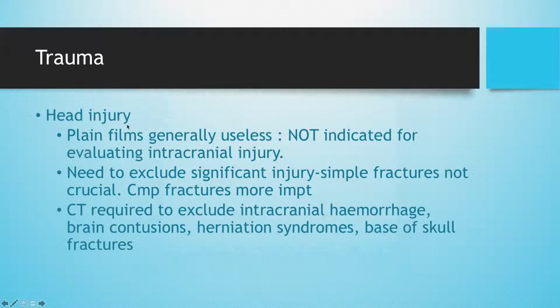We have a patient with head injury. Plain films are not very useful. If you have a simple fracture, it's not a big deal. If you have a fracture, you worry whether it's a compound fracture or whether you have a bleed associated with the fracture. Then you need to go to CT. So you need that to exclude intracranial hemorrhage, contusions, herniation syndromes, basal skull fracture.